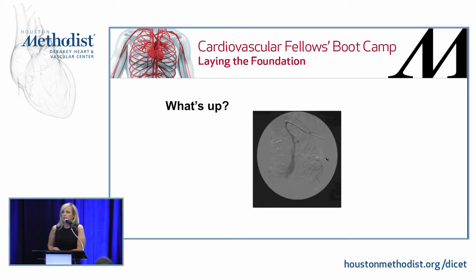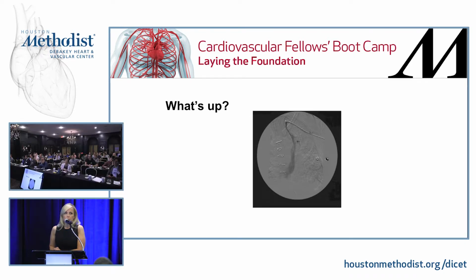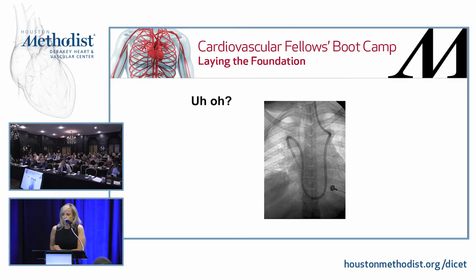What's up with this one? Can anybody tell me where this catheter is? What vein? So that's the accessory hemiazygous on that side. So again, not an ideal placement for leaving a catheter in at that point. How about this?